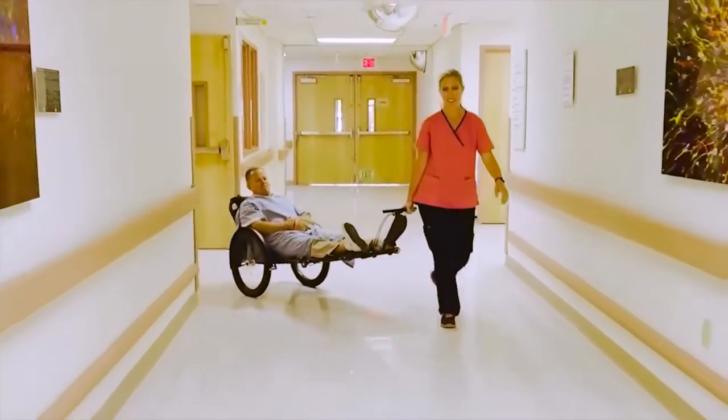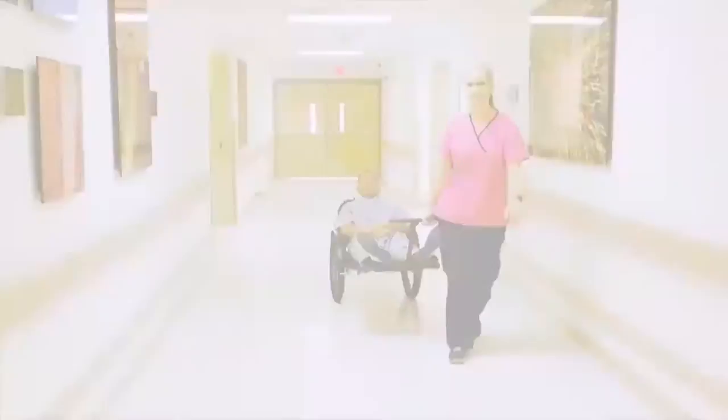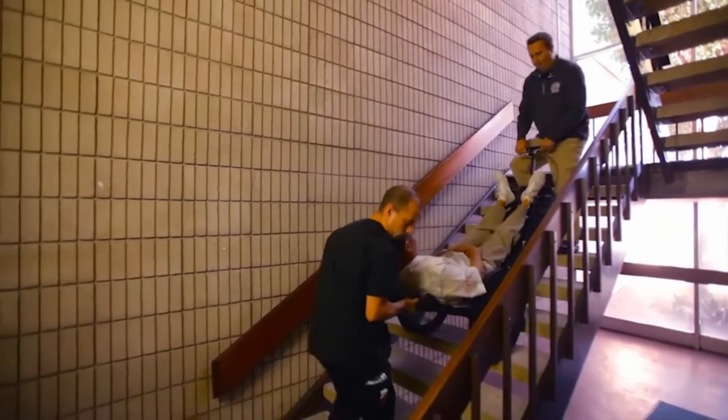Getting from the floors upstairs to downstairs, we don't have to move the patient from a bed to a different type of evacuation tool, back into a wheelchair or a gurney. Rex allows you to move the patient from the bed to the Rex, down and out of the facility.